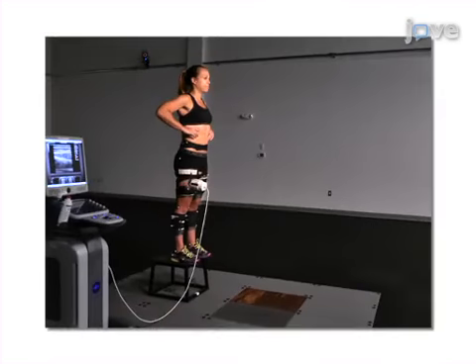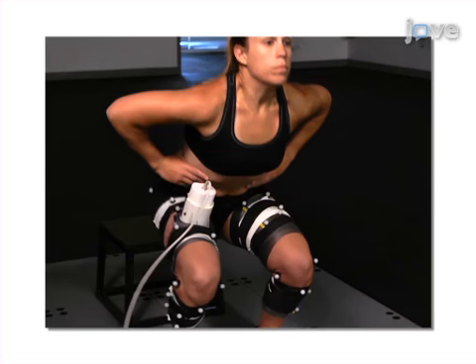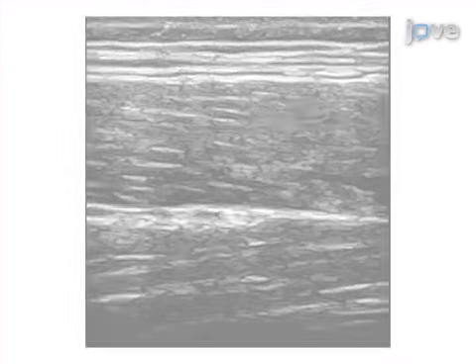Then, while standing on a platform, the subject performs the drop landing task by dropping from the platform and landing with both legs simultaneously. Ultimately, results can be obtained that show the rectus femoris muscle kinematics during a drop landing task through vector tissue Doppler imaging, as well as quantifying joint kinematics and kinetics using the motion capture system.